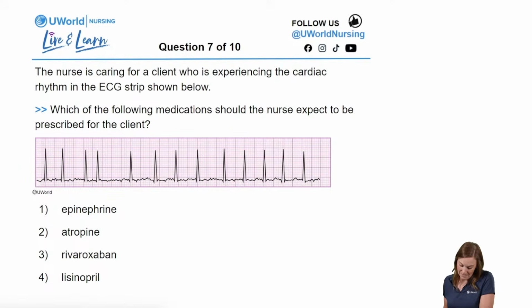That's awesome. Seeing a lot of good answers come in. Good job, you guys. All right, let's pull up our answer.